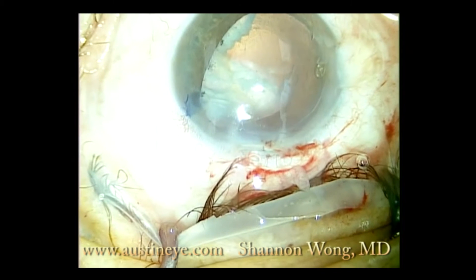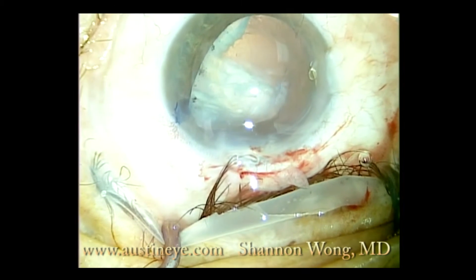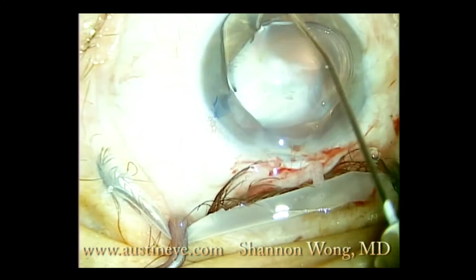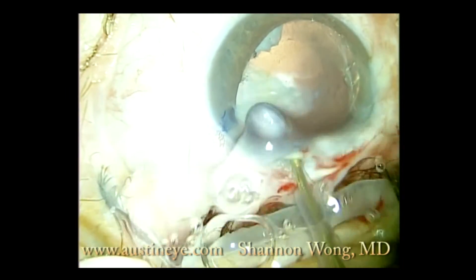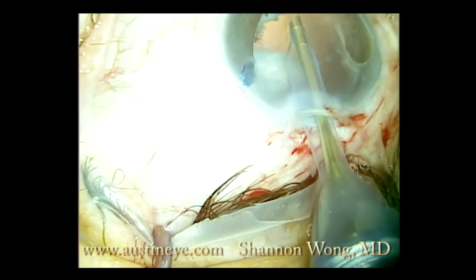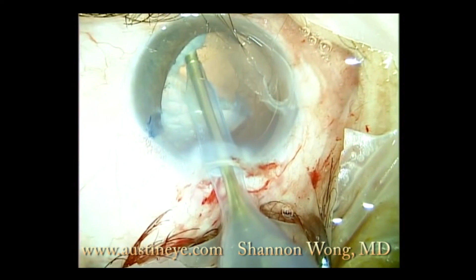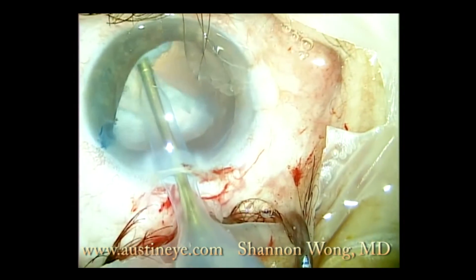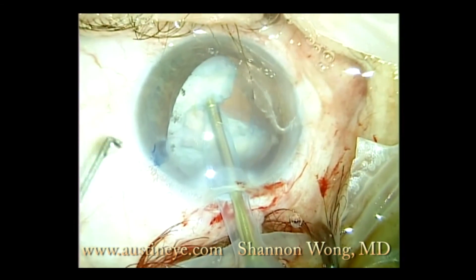The fact that this was this gentleman's only functional eye, and he had no medical insurance and was paying out of pocket for this procedure, meant that if we had to send him to a vitreoretinal surgeon to complete the work, that would incur added expense and added surgical risk of complications. So we wanted to do everything we could to make sure we got a lens in this gentleman and got the cataract out safely. Once we inserted the capsular tension ring, we had a more stable capsular bag which allowed us to safely remove the remainder of this cataract.